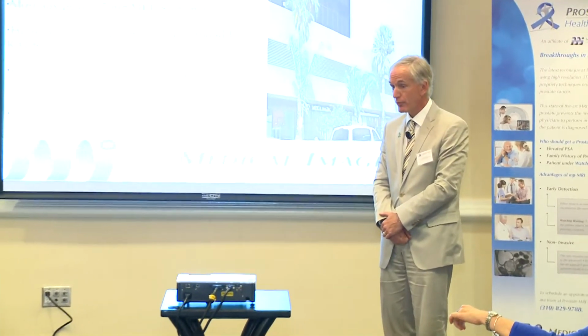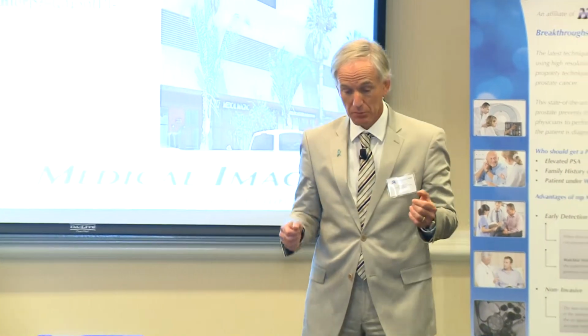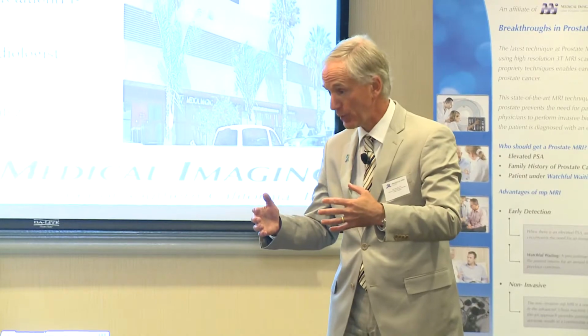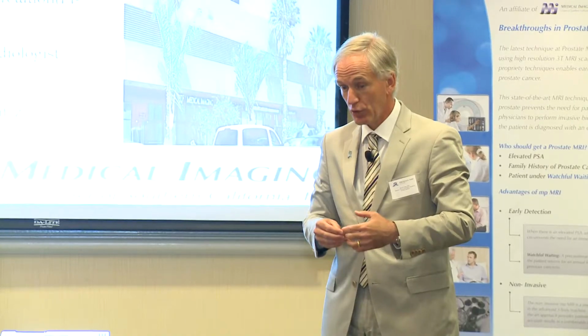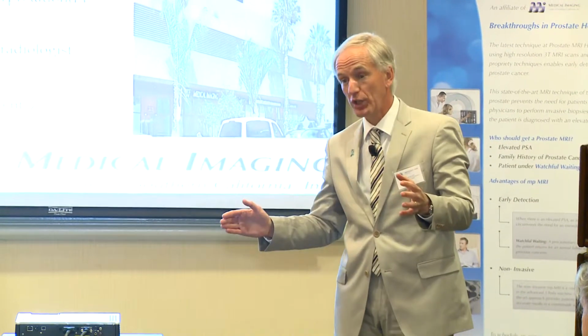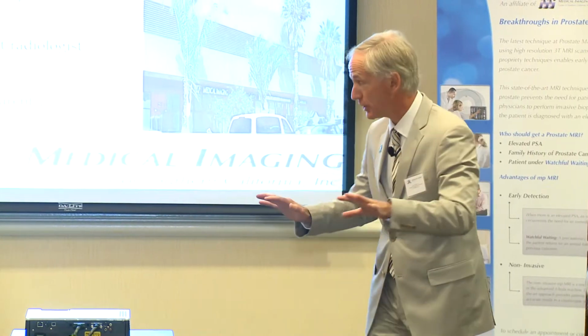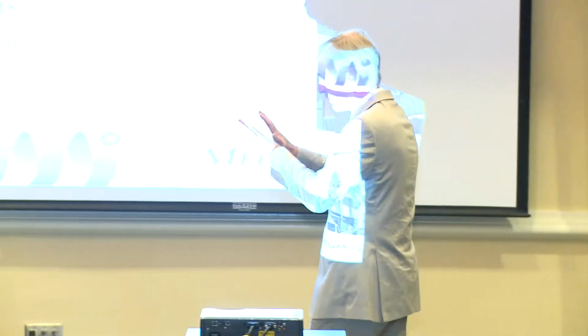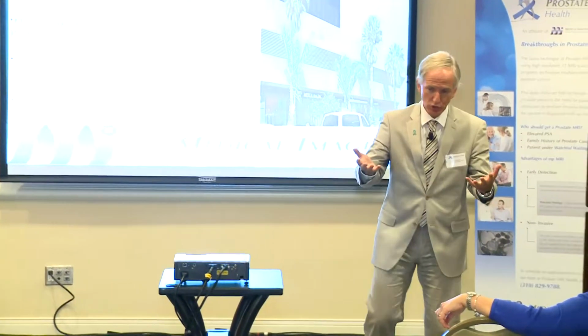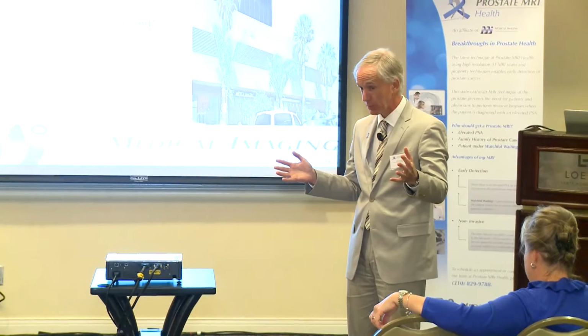The answer is yes, we can eliminate many of the biopsies, especially TRUS biopsies. If you're under active surveillance and the MRI doesn't show anything because you have insignificant cancer, you need to use MRI to select patients, by the way. So you have a negative MRI, you just happen to have a diagnosis of Gleason 3+3, minimal tumor, repeat the MRI in 1 year. If it doesn't change, and radiologists are very good in comparing two images, we are very accurate in seeing the differences. If the T2 doesn't change, if the diffusion isn't restricted, go home, be happy, come back next year. Only a 20-minute exam, no needle.